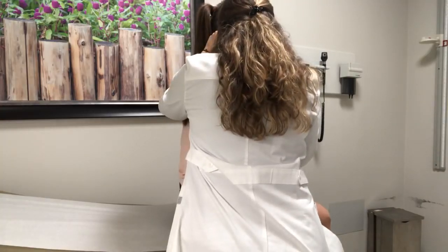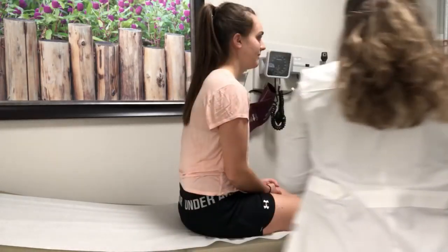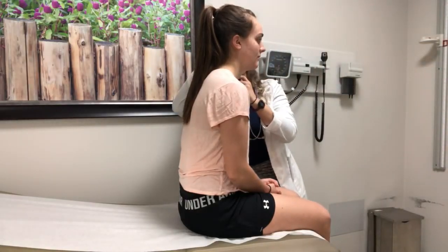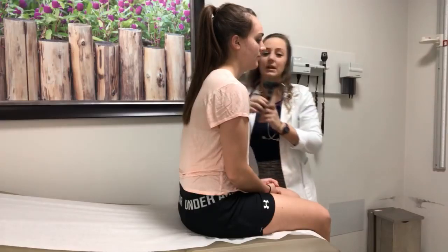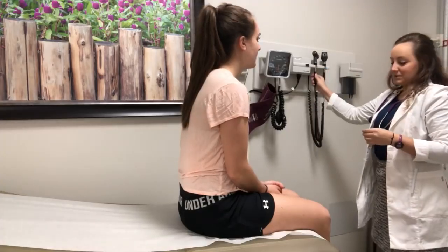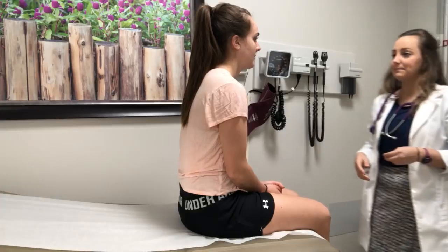I can see the ear canal. I can see her tympanic membrane. It's pearly gray. And I can see her malleus, incus, and stapes. Oh, that looks good. I'm going to look at this one too. I've already palpated this auricle. Awesome. I can see once again her tympanic membrane, her ear canal is intact, no trauma. I can see her malleus, incus, and stapes. All that looks great. Good job. Okay. So now I'm going to test your cranial nerves, okay? All right. So I want you to close your eyes for me.